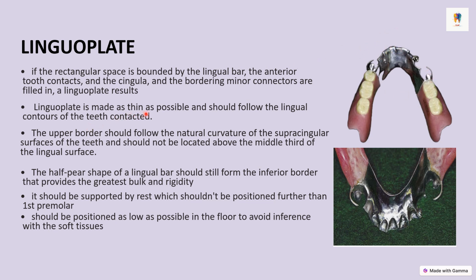A lingual plate is made as thin as possible and should follow the lingual contours of the teeth it connects. This is another picture of the same denture. You see this area is covered up to the cingula of the teeth and it follows the contour of the teeth. It is the same as the contour of the teeth.